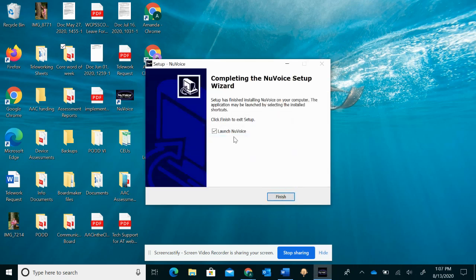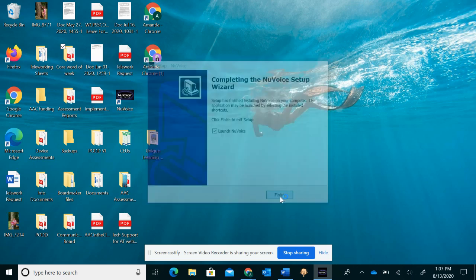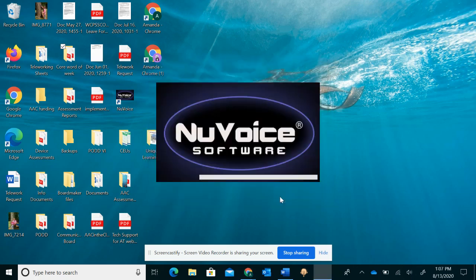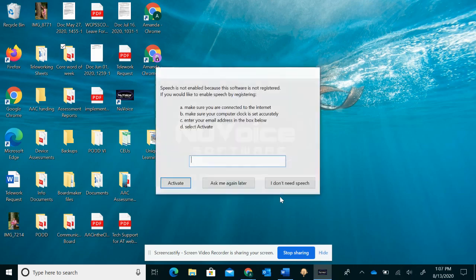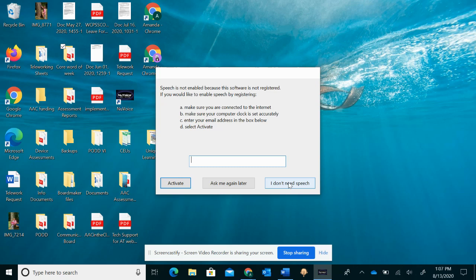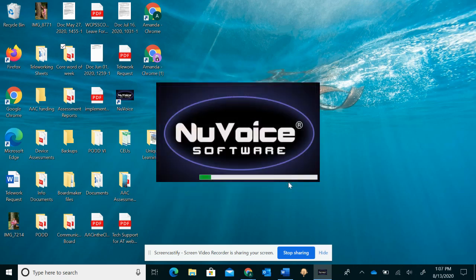Now you're going to click finish and it says finish. I'm going to launch new voice when I'm finished. Here it goes. So this is what software looks like. I'm just saying speech is not enabled because it's not registered. We're just going to say I don't need speech because that's not what we're using it for. We're just using it for the icons and just to get an idea of what a student's device looks like.